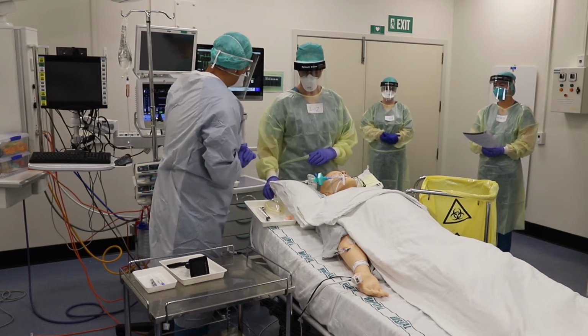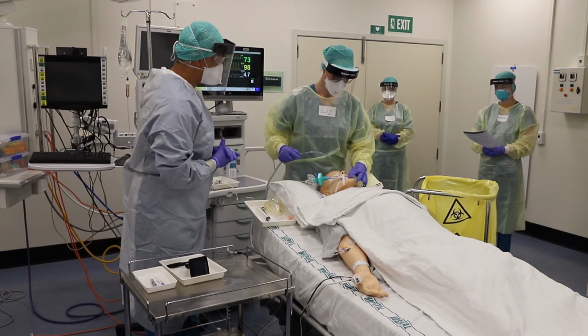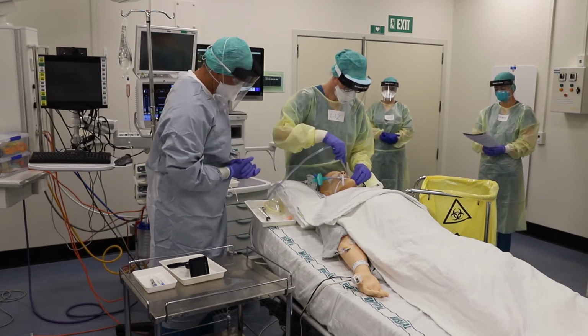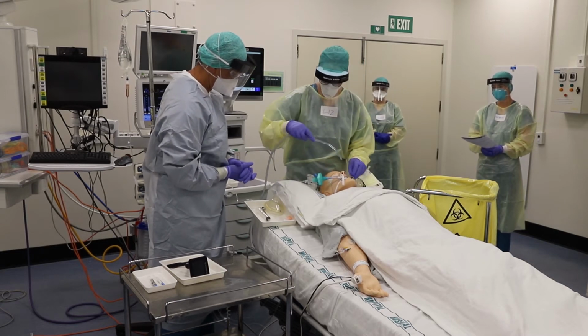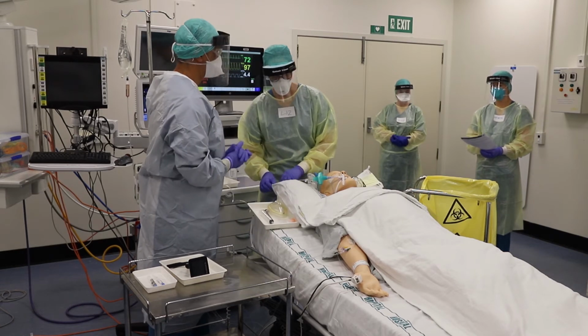Okay, I would like to suction. Sure. Can you turn it on for me, please? Of course. Suction on to maximum. There we go. Okay.